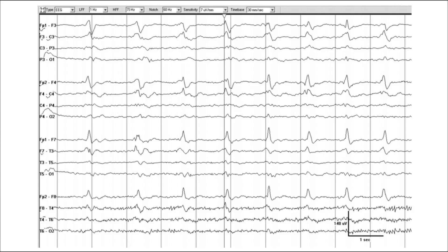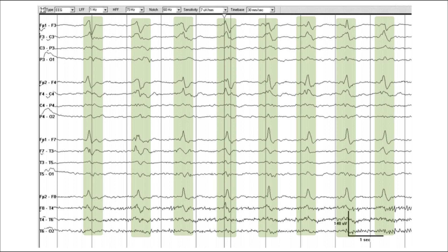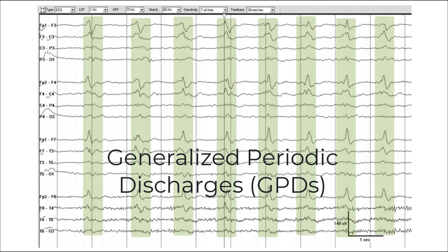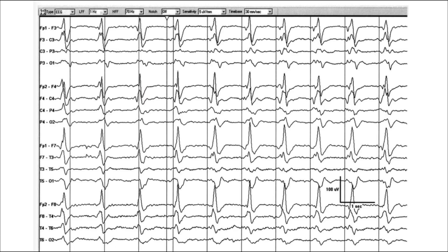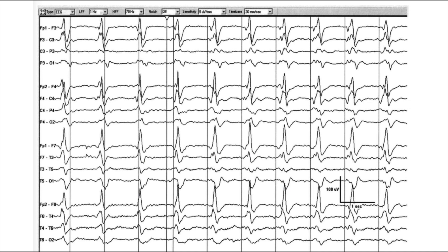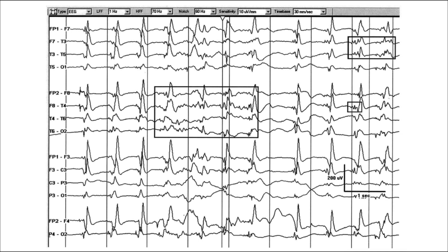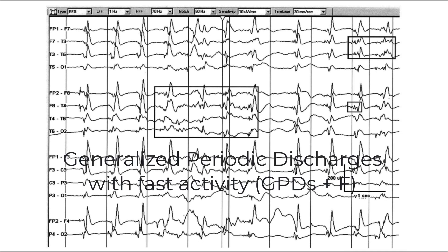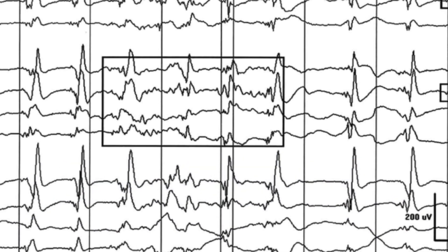Let's briefly look at some examples — starting with the first term, then the second term, then any modifiers. Here we see a pattern that is periodic with discharges occurring every second or two, generalized in both hemispheres with roughly the same morphology on left and right — generalized periodic discharges. Here is another example of generalized periodic discharges. And here is an example of generalized periodic discharges with superimposed fast activity, so we add the modifier plus F because there is associated fast activity with many of these discharges.